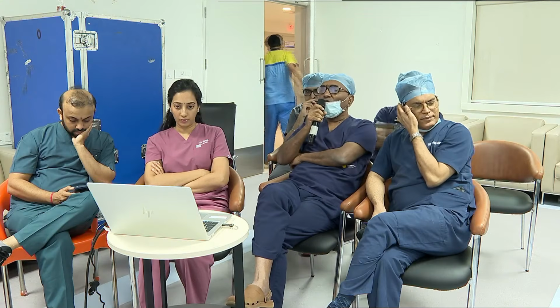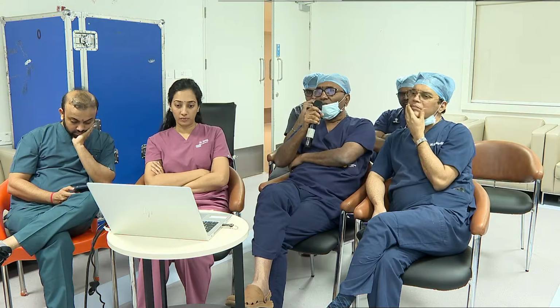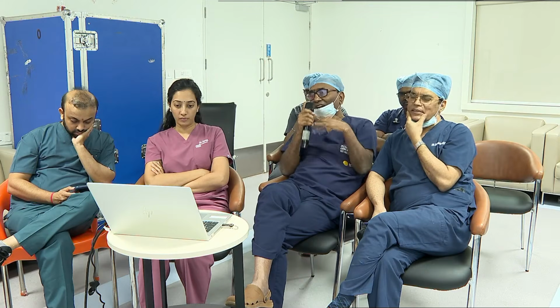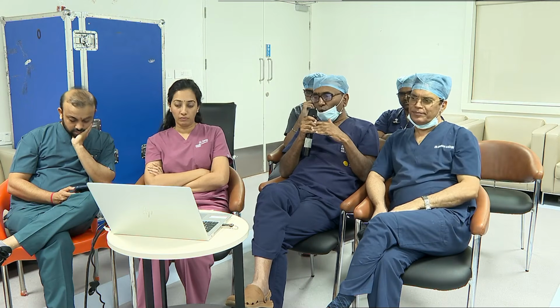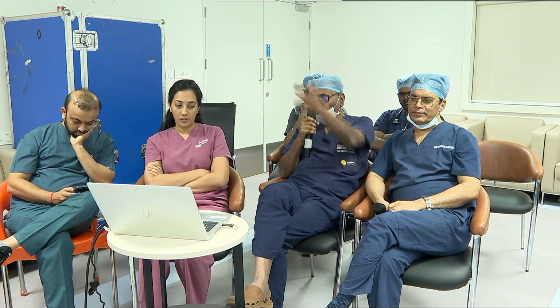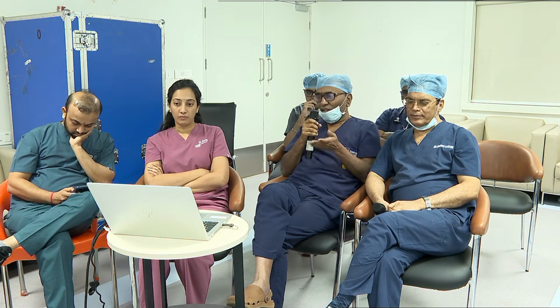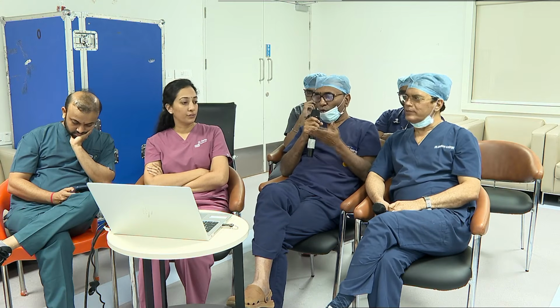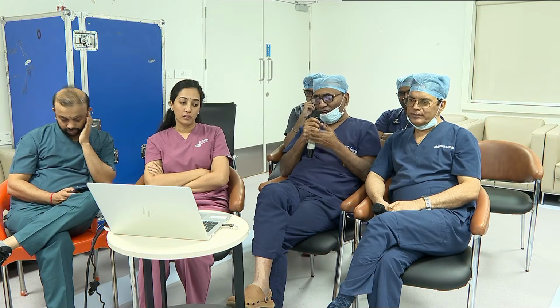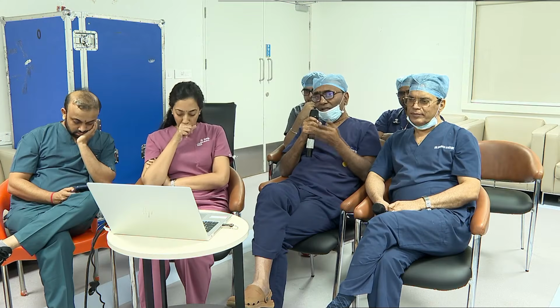So my question was, when compared to the Western population, the Indian population's lifespan is slightly lower. So we cannot wait until 65; for patients above 60 also, can we advise TAVR? That is the issue. I think it is reasonable for Indian patients to advise TAVR even for patients above 60 years, because we are one decade shorter in lifespan.